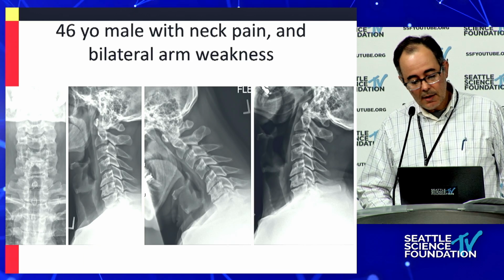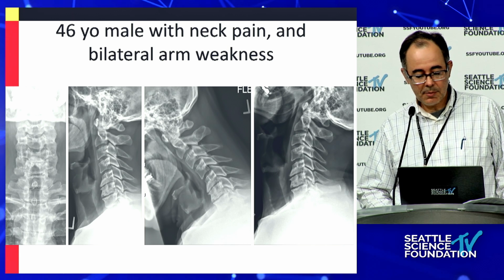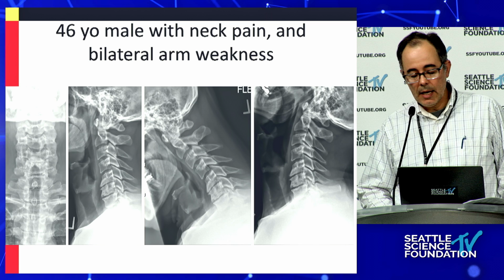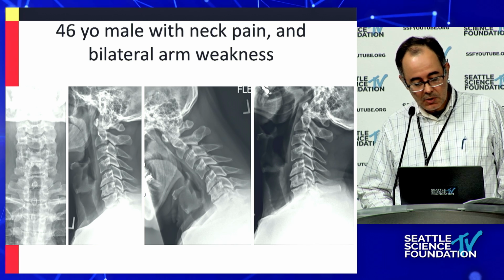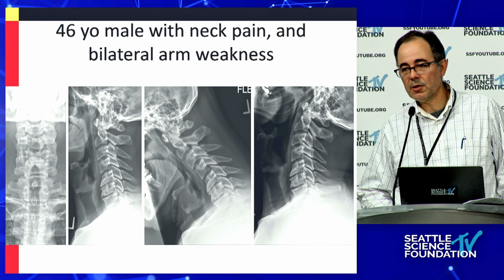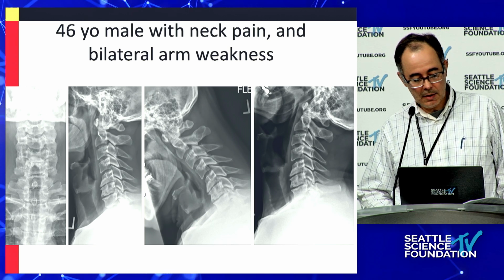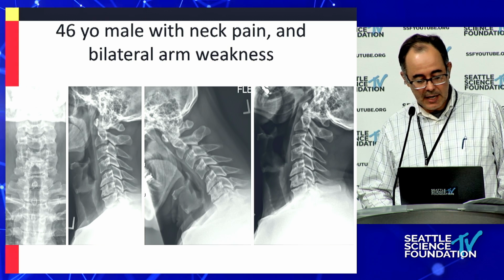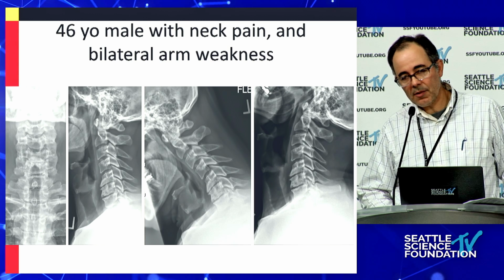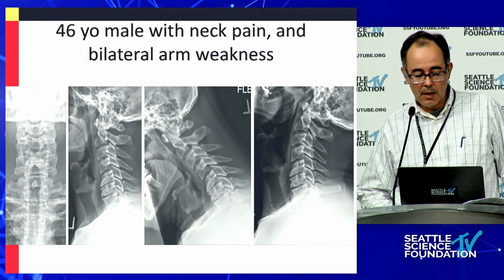This is a 46-year-old gentleman with pretty severely collapsed disc spaces, but very much desirous of motion preservation. I had a tough time with this one, and it was the patient that swayed me into the arthroplasty direction, but this classically would be a fusion patient.